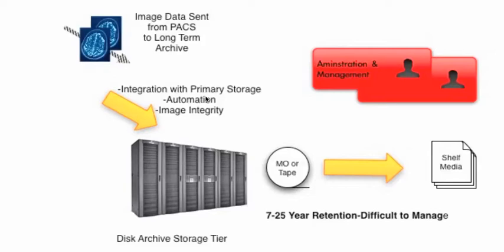What's active archive software? Well, there's another video on our website you can view to get an in-depth view of what active archive software is. But in a nutshell, it provides the automated movement of diagnostic study information through multiple tiers of storage as that study information ages. Again, we use active archive software to provide automation, but there are other ways that you can provide that level of integration and automation as well.